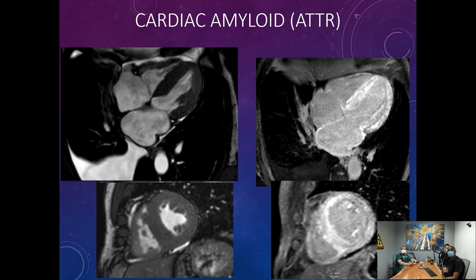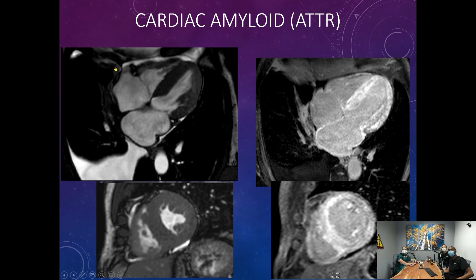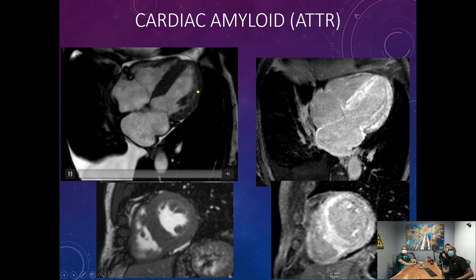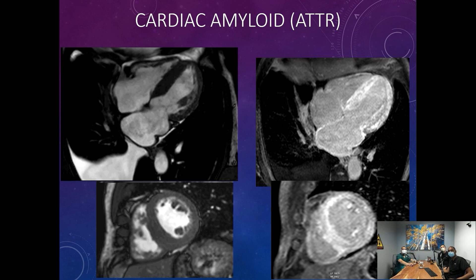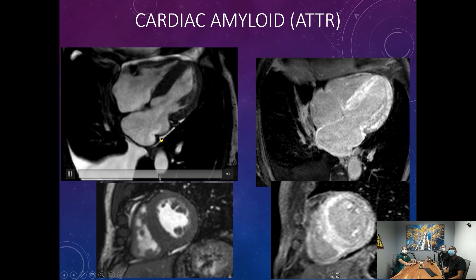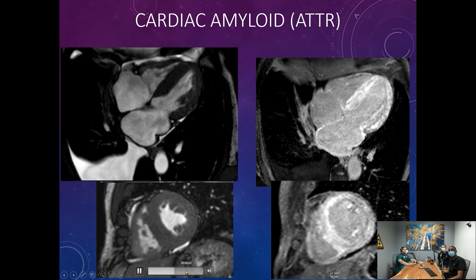Here is an example of amyloid. Comparing to our patient, you can see without gadolinium that the heart muscle is thickened, function is slightly reduced, and the atria are quite enlarged. This is also an example of a right pleural effusion, seen readily on SSFP — notice how fluid appears quite vividly. You can also see a small posterior pericardial effusion here.